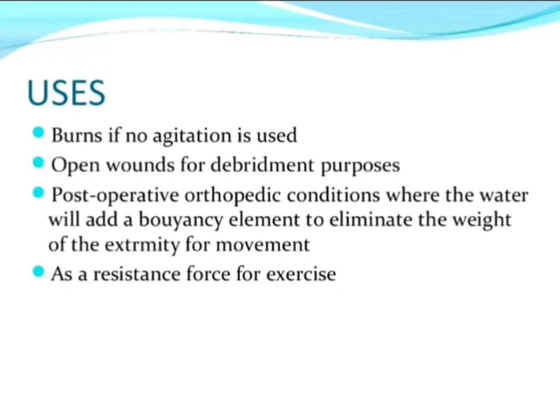So basic uses: open wounds for debridement purposes. For burns we can use it, but no agitation is used in burn cases. And post-operative orthopedic conditions, where water will add a buoyancy element to eliminate the weight of the extremity for the movement. And also we can use it as a resistance force for exercise, right?